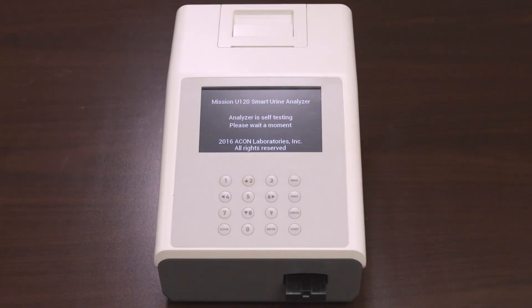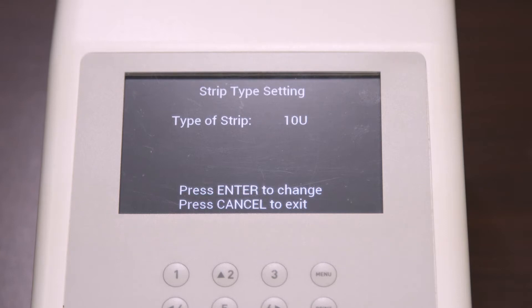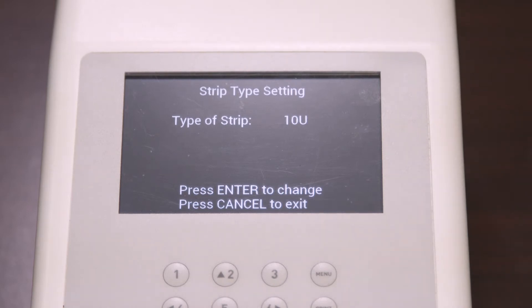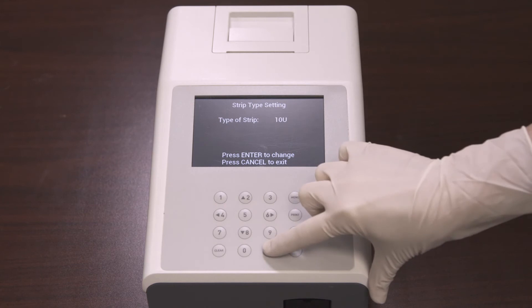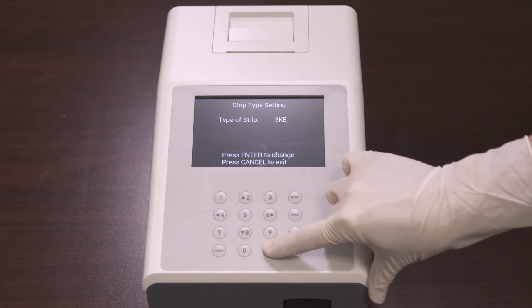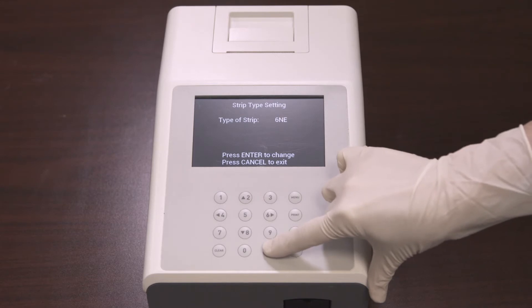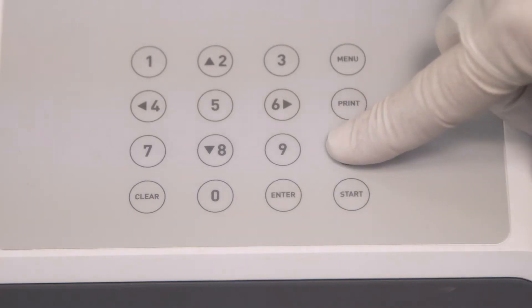Once the analyzer is turned on, it will run a self-test. After the self-test is completed successfully, the following screen will appear. Verify that the strip type showing on the screen corresponds to the type of strip that you will be running. If it is correct, press cancel to reach the main screen, also called the initial screen. If the strip type on the screen is not the strip type you intend to run, press the enter key to cycle through the available strip types until you reach the one you need. Once the desired strip type shows on the screen, press cancel to reach the initial screen.